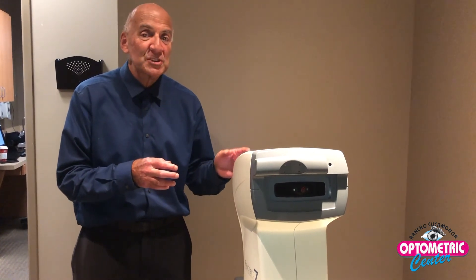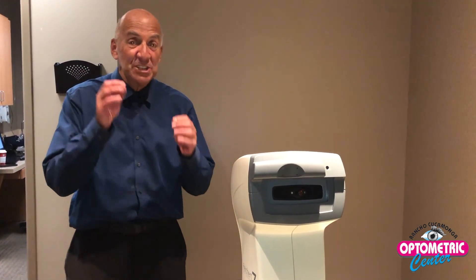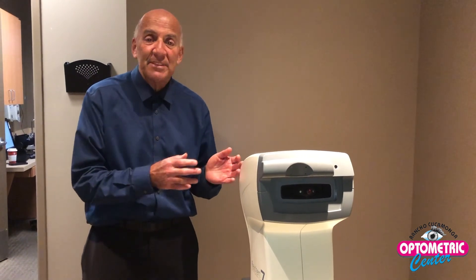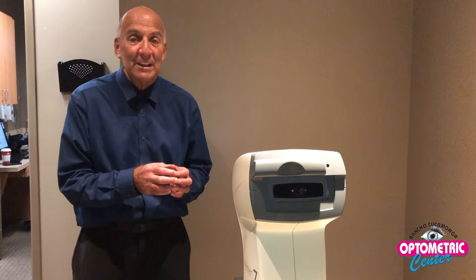There have been times when I've taken pressures on this and they are inordinately high, but I have another machine where we actually touch the eye with anesthetic to measure the pressure more precisely. This machine measures pressure for glaucoma, and glaucoma is nearly one of the number one reasons why you can lose your vision if it is not being treated correctly.